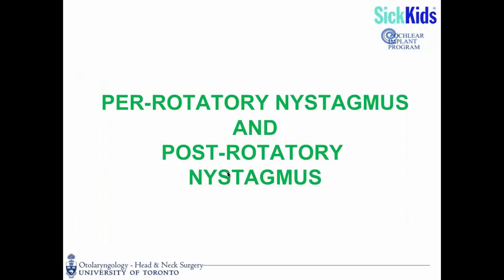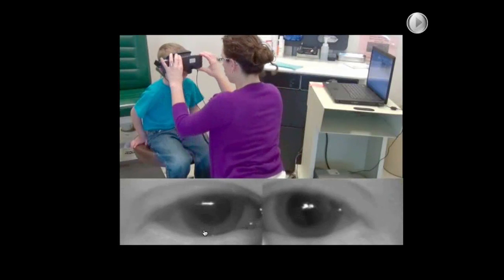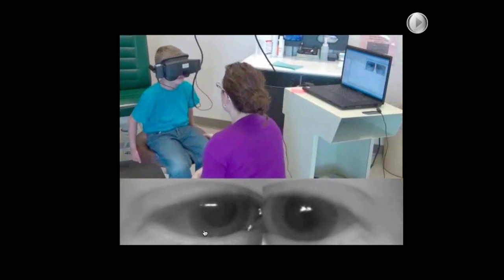So let's move on. The other things that I like to test in the clinic, and these are truly in order of preference, are per-rotatory and post-rotatory nystagmus. This is a fun test for children. There's a few tricks that you have in order to get them to participate. And what I'm going to do is I'm just going to show you a little video of how we do it in the clinic. When I use this test, I am using it qualitatively.